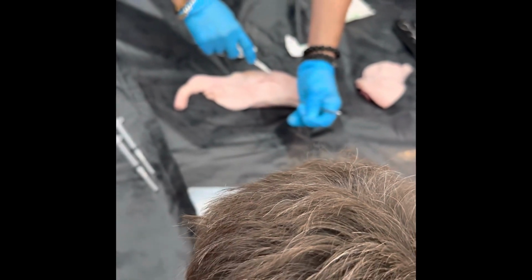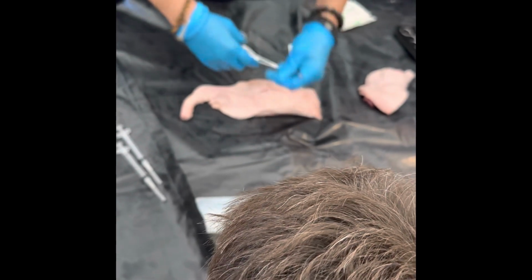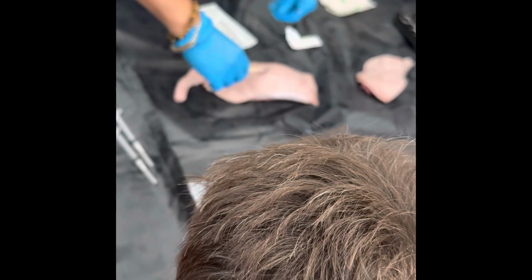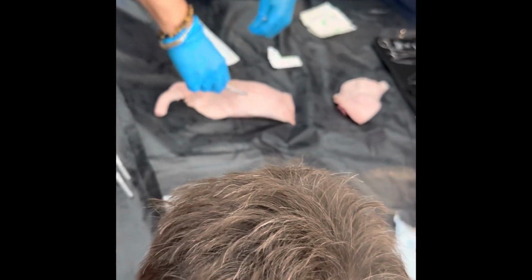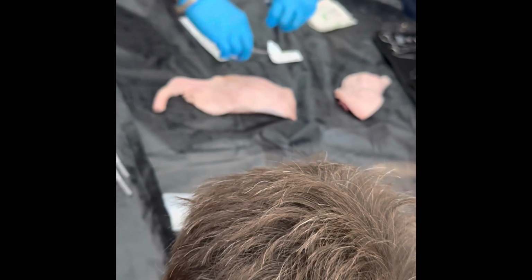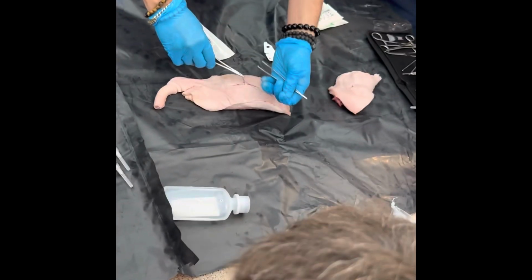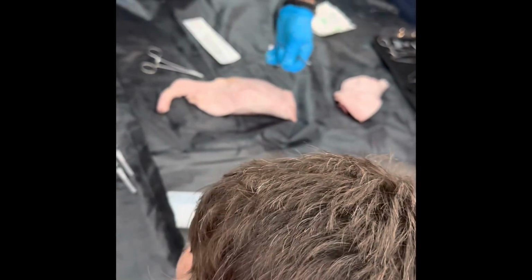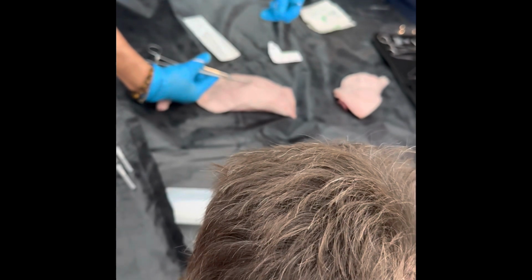So you're knotting each stitch? Yes, on this one, yes. And you're only suturing skin. You're not trying to get down into any of the other layers. If I see that it's really, really deep, I'll go in a little deeper. Okay, two, and then three. Okay? So basically, that's what we're gonna be doing.